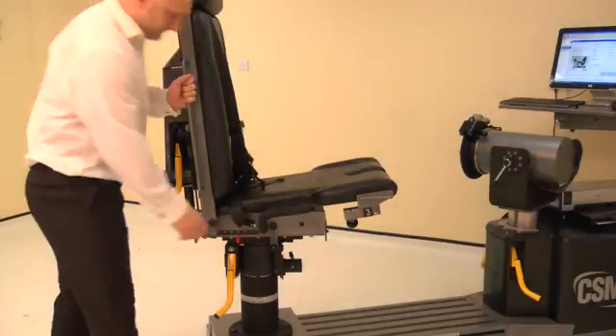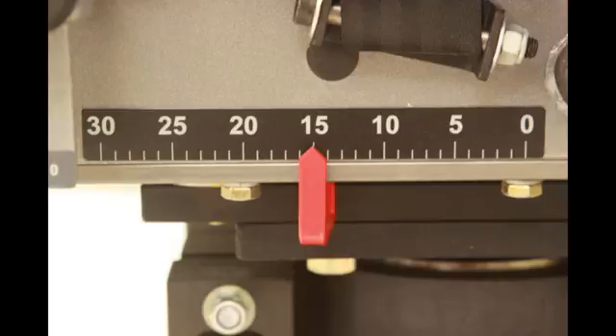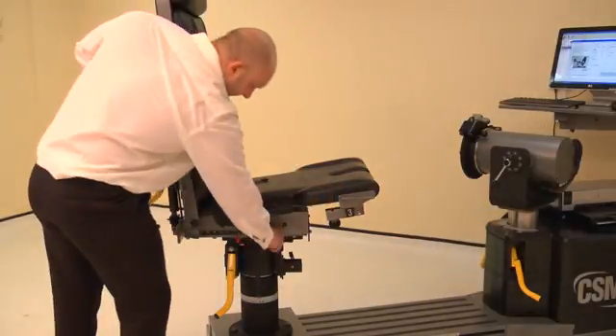The chair fore-aft is altered by raising either locking handle, then sliding the chair bottom forwards or backwards. Adjust the chair fore-aft to position 15. Lower the locking handle to secure.